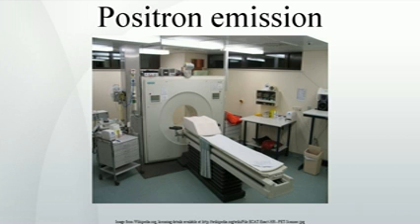Radionuclides and radiotracers. Radionuclides used in PET scanning are typically isotopes with short half-lives such as carbon-11, 20 minutes, nitrogen-13, 10 minutes, oxygen-15, 2 minutes, fluorine-18, 110 minutes, or rubidium-82, 1.27 minutes. These radionuclides are incorporated either into compounds normally used by the body such as glucose, or glucose analogues, water, or ammonia, or into molecules that bind to receptors or other sites of drug action. Such labeled compounds are known as radiotracers.